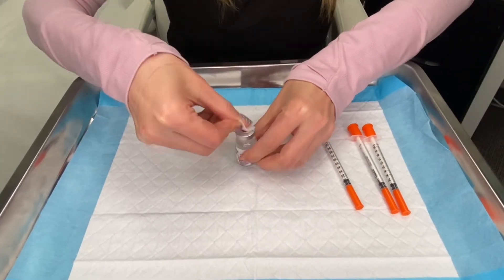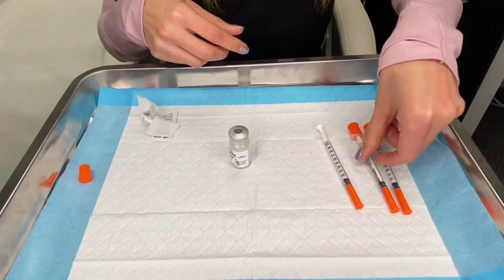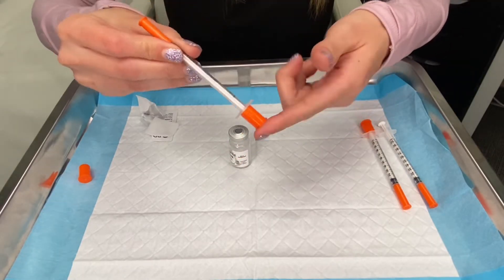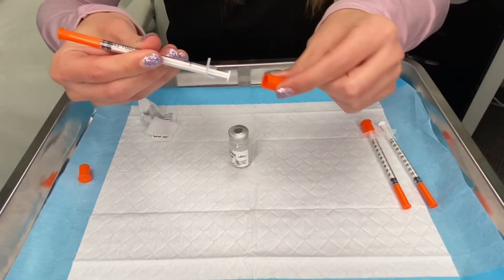You are going to swab the top of the vial to clean it with your alcohol pad. Next, you're going to take one of your syringes — there's a stopper at the bottom. You're going to take that off, and once you take it off you will not be replacing it or putting that back on.